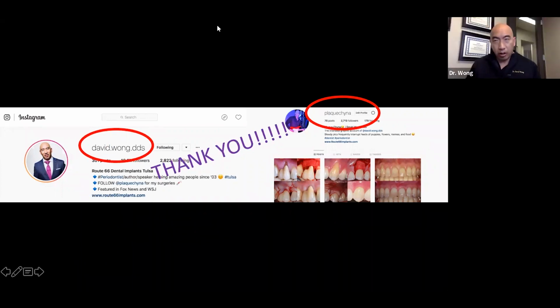Yeah, so the cone part goes in first, right? The cone part goes in first over the labial, basically patching the fenestration. So it actually goes into the socket. And then you graft the material and adapt the ice cream cone part up against the wall and the fenestration. So you're packing that socket. At that point, the only thing you should have left over is the ice cream part, right?